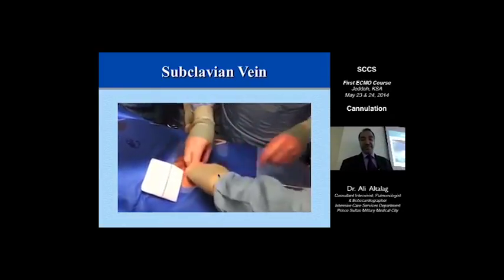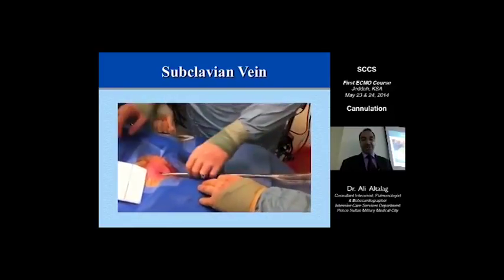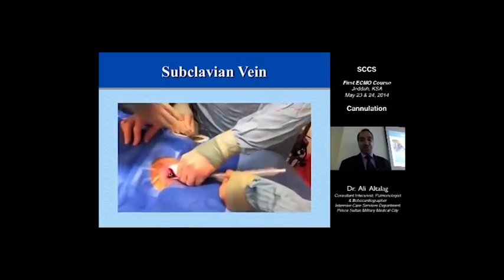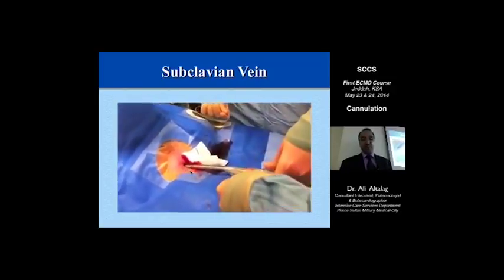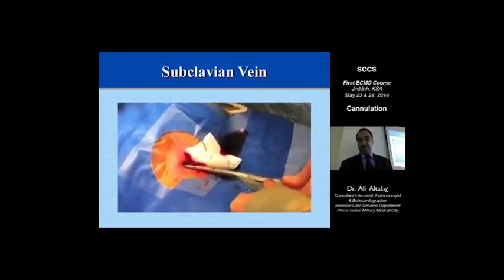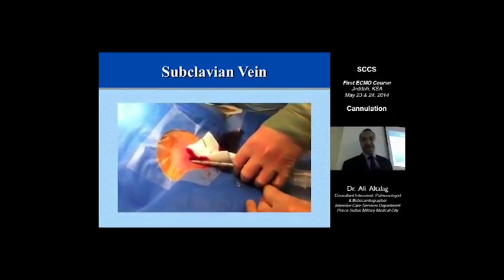Then you pass the catheter slow and nice with a little bit of rotationary motion. Make sure that the side hole is going. Now you see the blood which is coming out because you have multiple holes. That's why some blood, once the first hole goes in, the blood will come out from the other holes. Make sure that the side port is towards the patient's face or head.